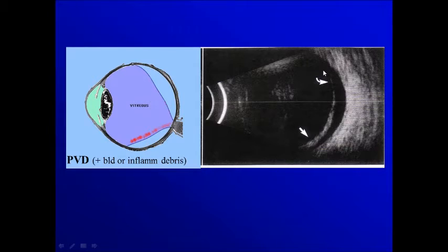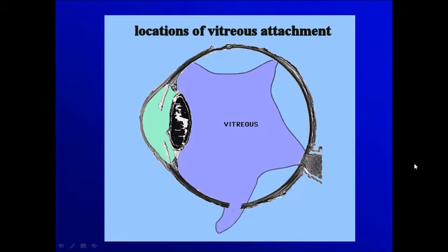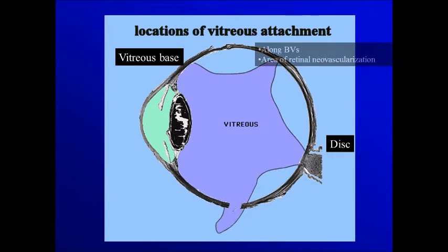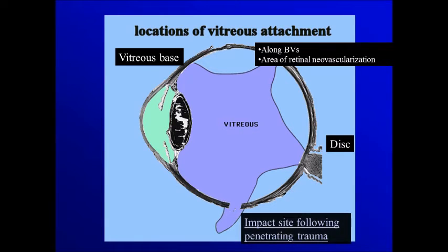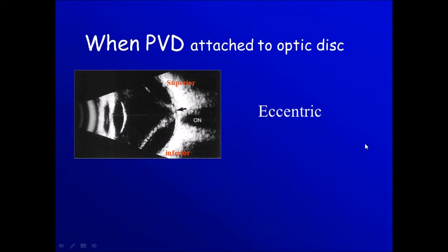If you compare the lower part with the upper part — normally we have points of attachment between the vitreous and the wall. These are at the disc area, at the vitreous base, along the blood vessels, or in areas of neovascularization, and following a site of perforation to the walls.